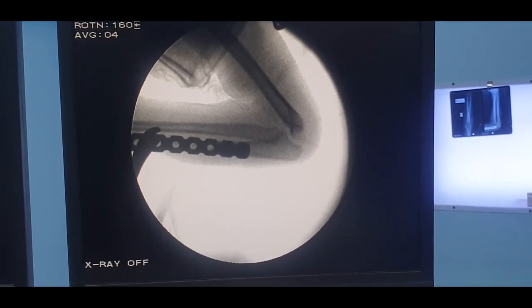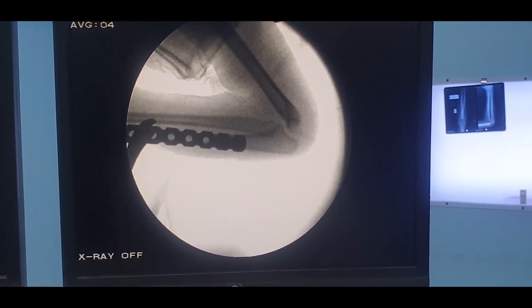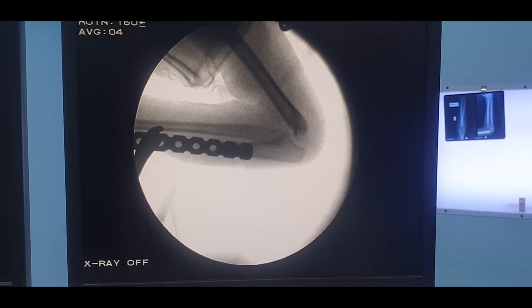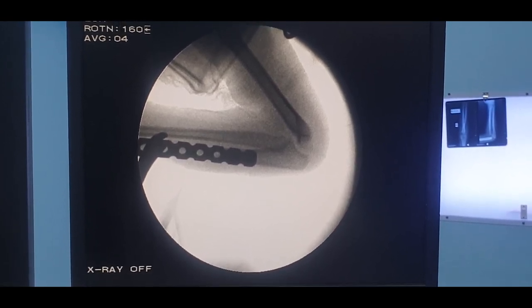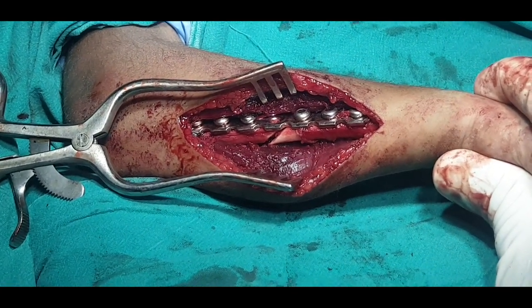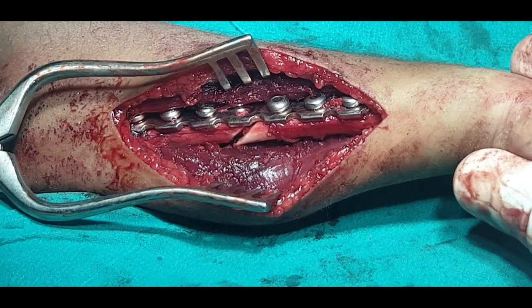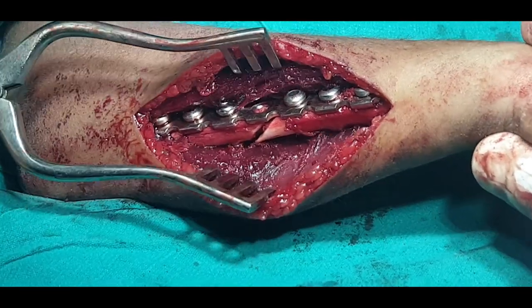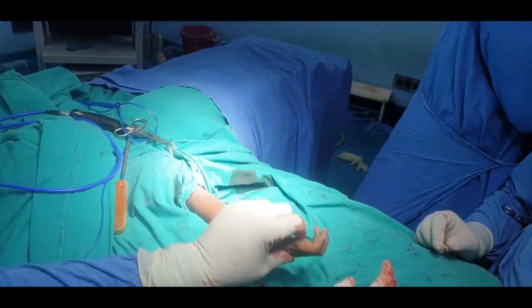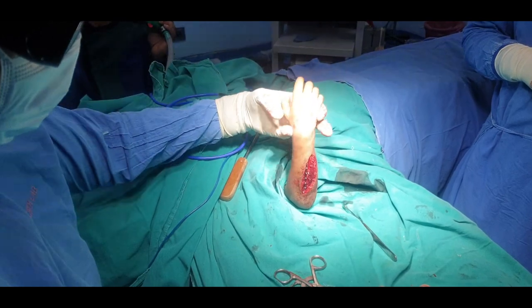Looking at the C-arm, I am quite pleased that this joint has nicely reduced. I don't have to open the joint and do an open reduction, which will be good for this girl as well. Next step will be to put the screw in the distal aspect of the ulna in the position where we have gained the length. This is our final fixation — you can see we have gained around 2 mm of length. Some of the length came as we reduced the bowing of the ulna. I am delighted to say that previously this elbow was only bending up to 90 degrees with a lot of force, and now you can see it is flexing completely, extending completely, full pronation, full supination.